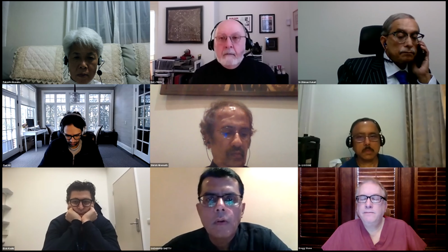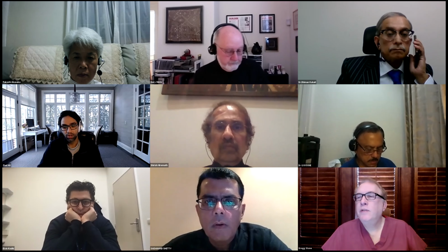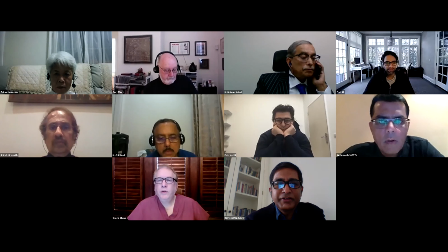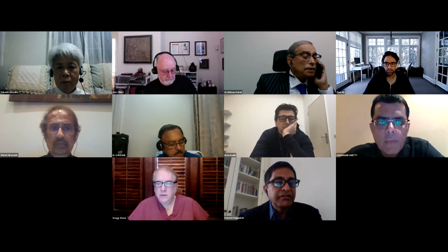I think in the meantime, is it okay to ask a question to Ziad? Of course. Hey Ziad, this is Ramesh. Very nice talk, fantastic as always. I just wanted to ask you, in real world practice, I don't actually get the results of laser as I would love to. Somehow the laser results are suboptimal in my practice, at least in my opinion.